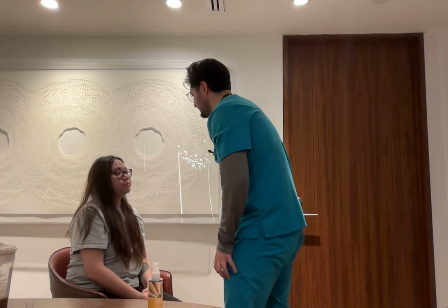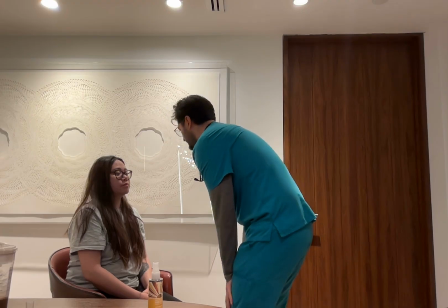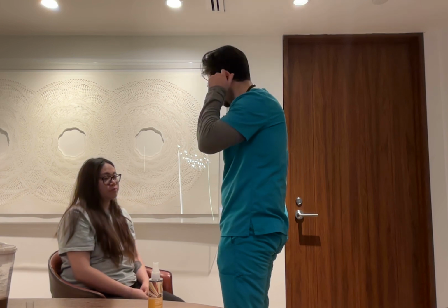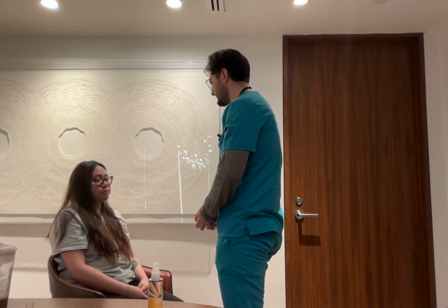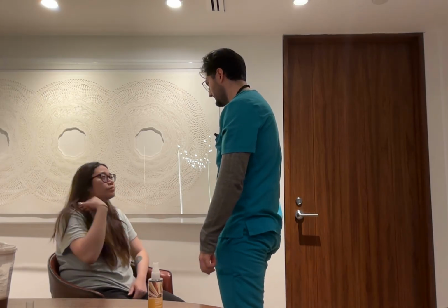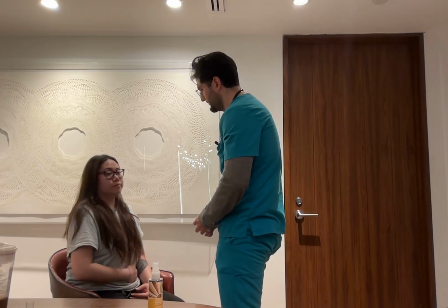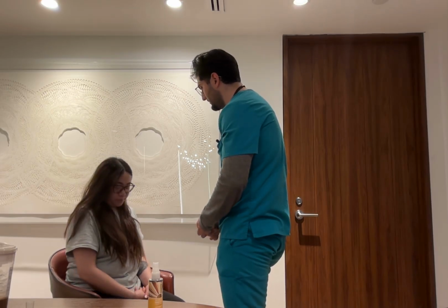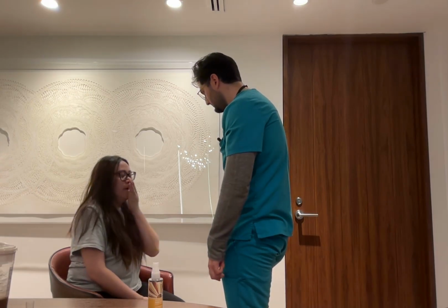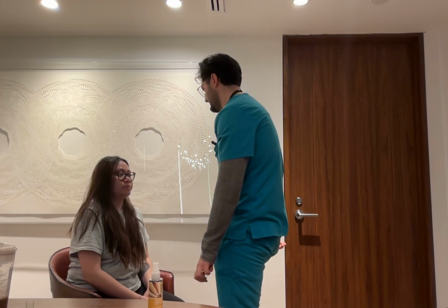Now I'm going to move laterally to the ears. I would assess the ears with the otoscope. Using the otoscope, I would pull the auricle up and back because the patient is an adult. And I would look into the ear canal first, assessing for any redness, discoloration, swelling, which there should be none. Then I would look further into the tympanic membrane. It should be gray-pink in color. The light should reflect back off of it, and there should be no effusions present, and no swelling, redness, or discoloration on the tympanic membrane.